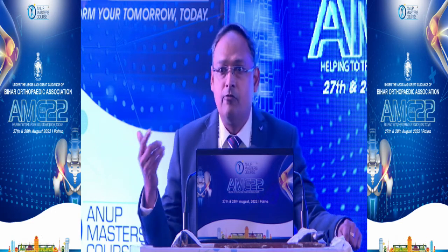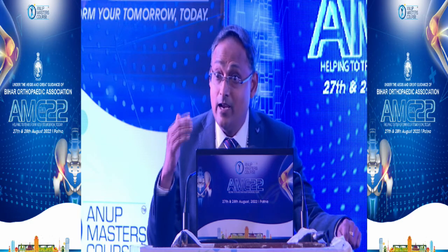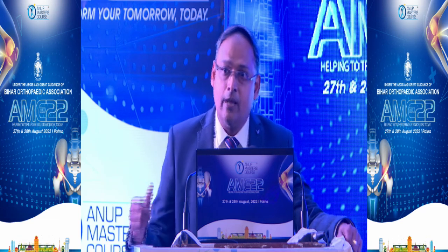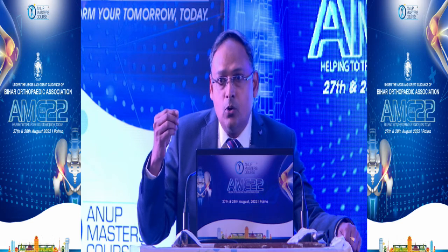Most important, you have to fashion the bone graft in a way that it fills the defect. Sometimes you may have a problem with the amount of bone coming out from the cuts. You may not get an appropriate size of bone graft. Number two is that if the bone is sclerotic, it can be an issue for graft absorption. Definitely, sclerotic bone should not be used. So in those scenarios, to give immediate stability, metallic wedges will give you that bailout, because immediately you can go for weight bearing, as you are not concerned about bone resorption.